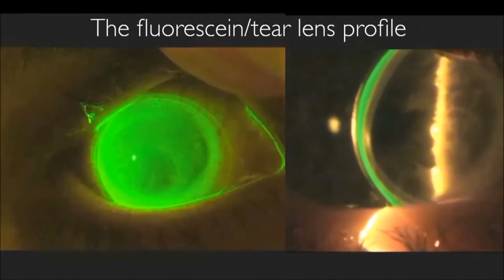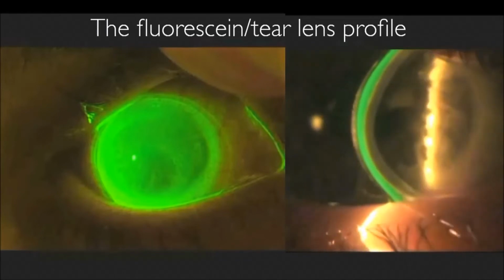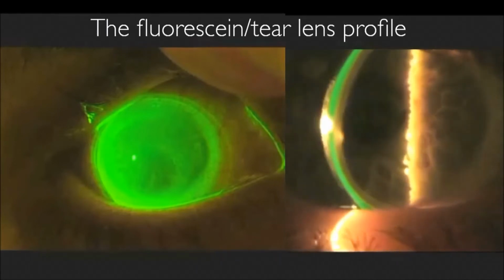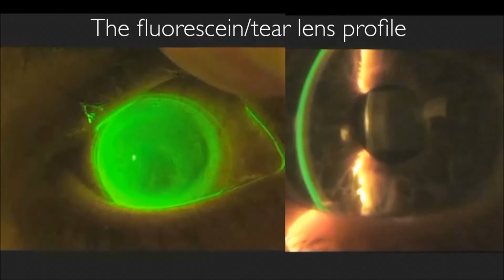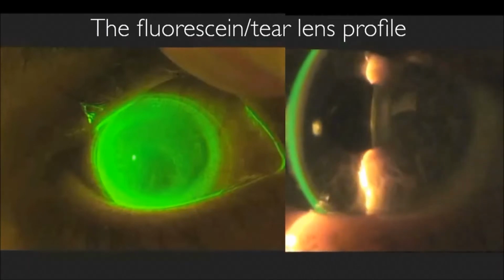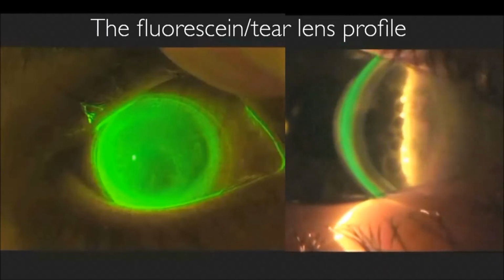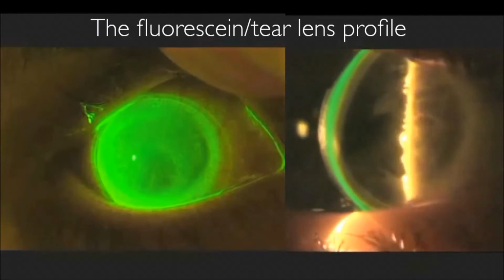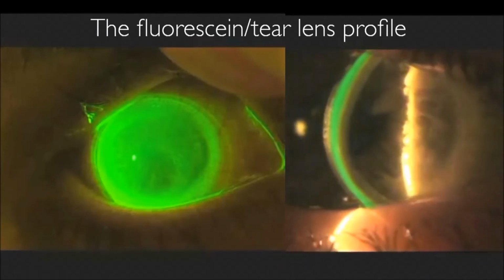I turn the light up to its highest intensity, and with the optic section, I actually look at the height of the lens beyond the cornea, and I judge that by looking at the fluid layer in between the lens and the cornea. The lens has a certain depth to it, or a certain thickness, and I can use that as a yardstick to actually predict or to measure the thickness of my tear layer. Both of these fluorescein patterns are useful. The more useful one I find is the optic section.